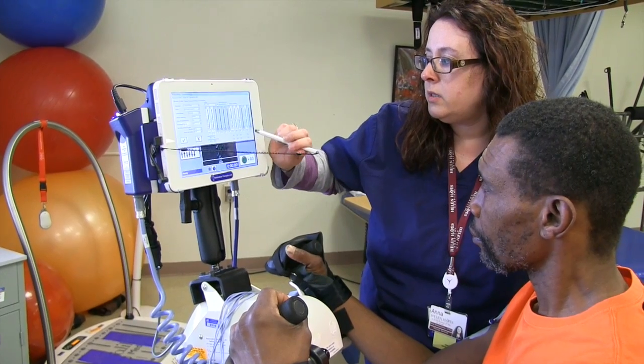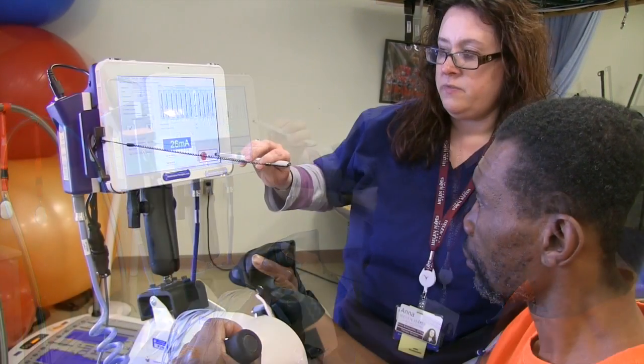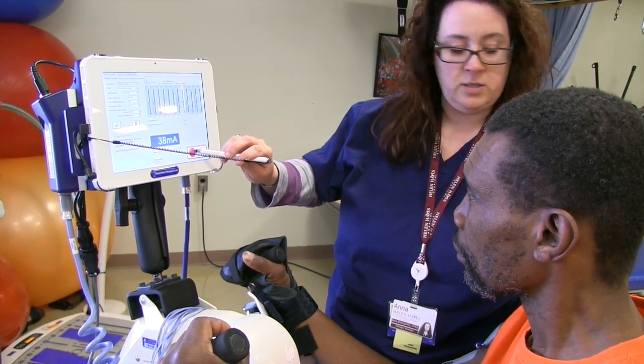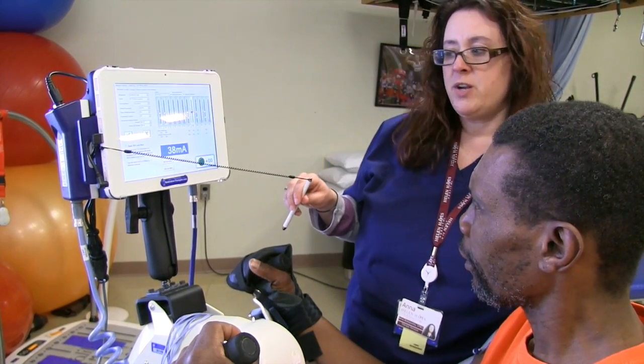Let's start with the scapula right there. How does it feel? It's not bad right now. Did you feel it just kick in? So I know it kicked in.